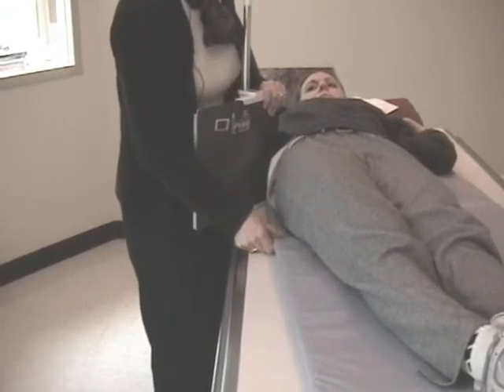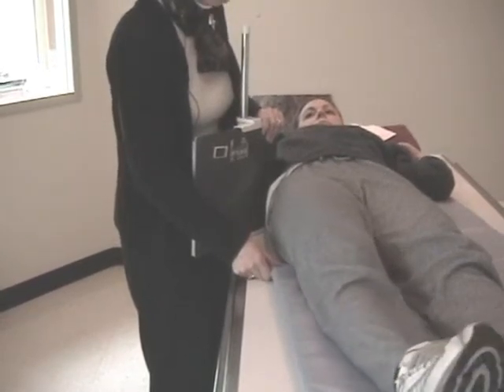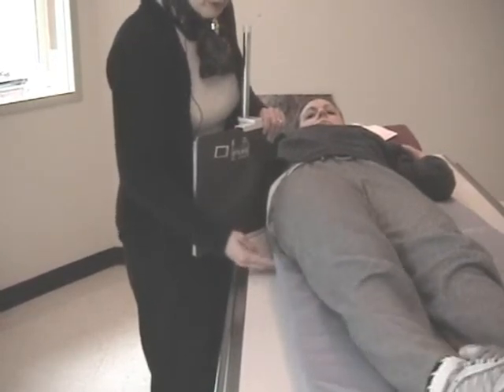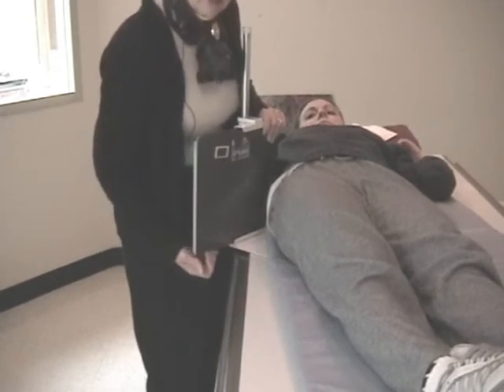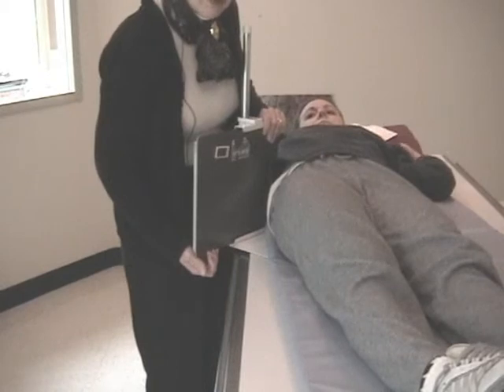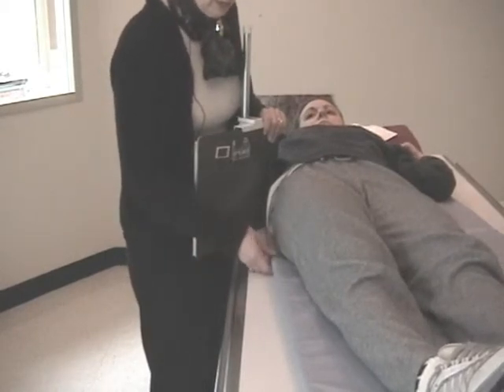Jacqueline is not heavily built. She does not have a lot of adipose tissue. She's pretty much resting on bone. If we did not build her up with a sponge, this edge of the cassette may clip anatomy. So with any smaller patient, it's an excellent idea to build them up with a sponge.